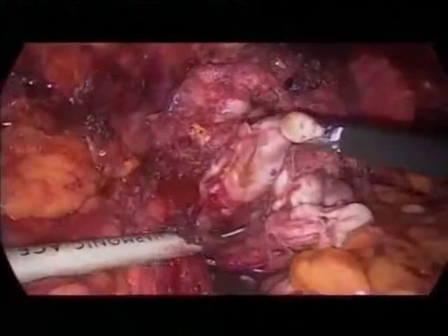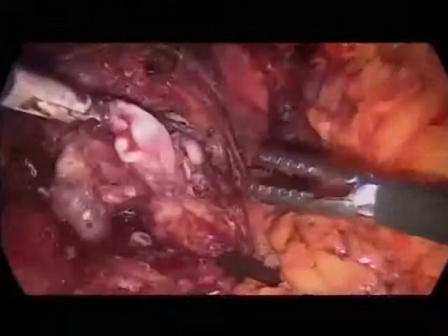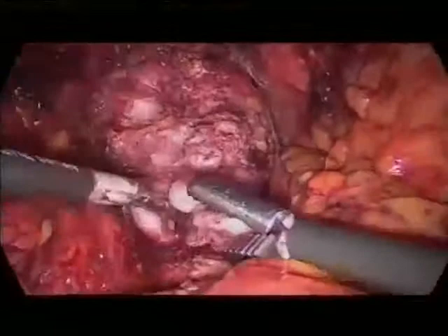So now I would like to stop to use this instrument. I'm using clips and the scissors to mobilize all the nerves lateral here of the prostate. And we have the same situation on the other side. Take this. First of all, we show here, you see this I have already shown you at the beginning, and the same from here, and all this is pedicle inside this here. Good. Very nicely shown. Thank you.